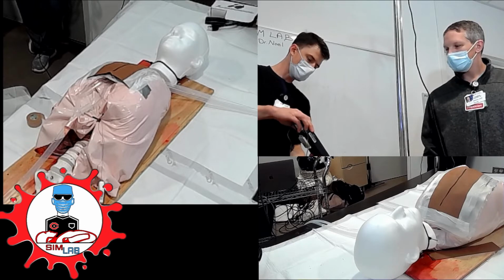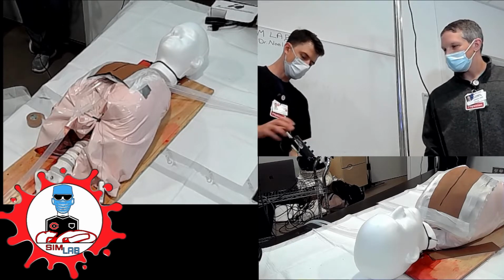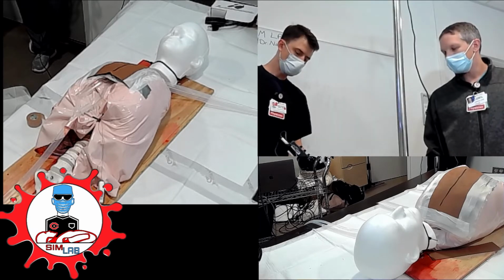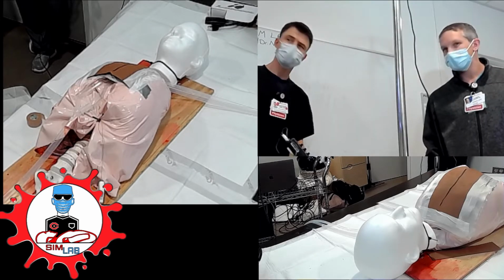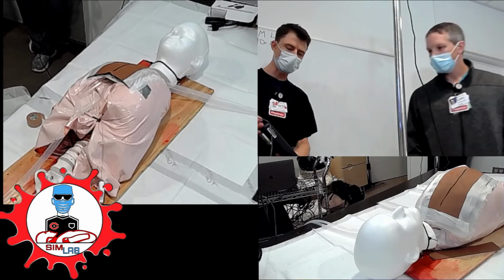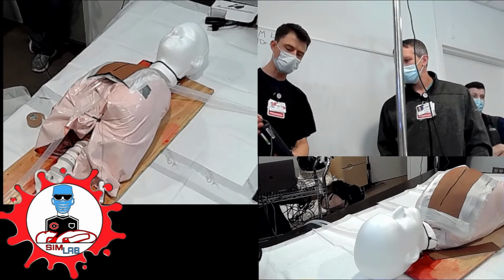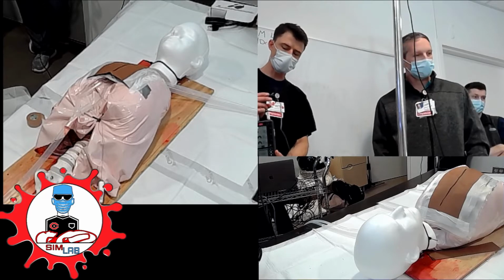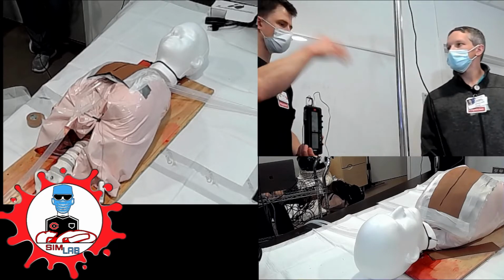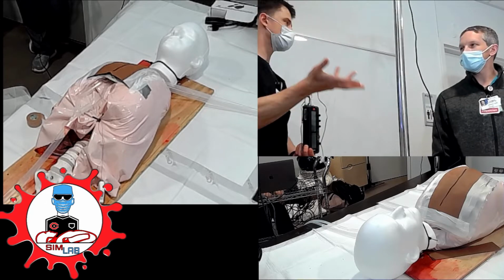Okay, so what did it do? Increase the output for the A and B. Milliamps. Okay, so increase it, max out the output for the A and the B, right? So it went to milliamps 20 on A, 25 on B. It's asynchronously pacing, so it doesn't care what the rhythm does, it's going to keep pacing. So that's your best chance at pacing this patient.